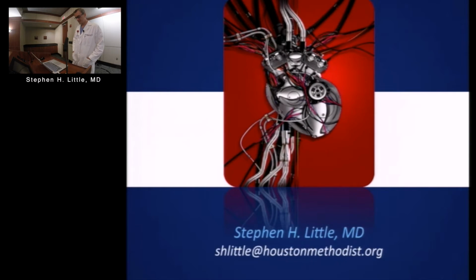Yeah, that's a bit of a loaded question. Centers across the country are solving that in different ways. I know some centers where cardiac anesthesia does it, where they do all the MitraClips, all the TAVRs. That's not typical. Some places have a 2-tier. It starts with anesthesia with the call for help button to get cardiology. Some places it's sonographer driven.